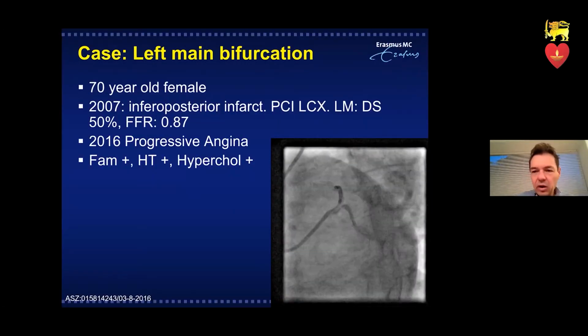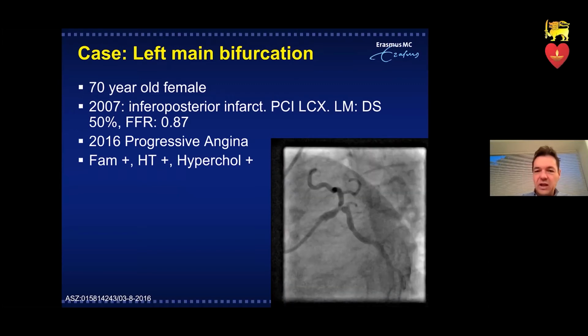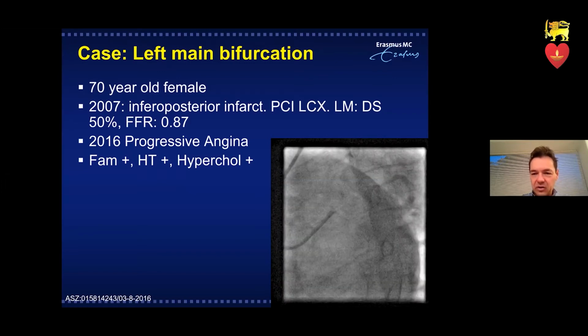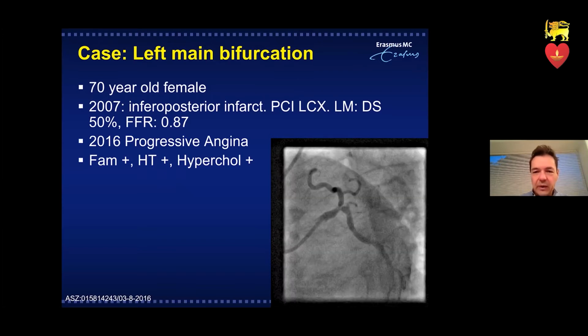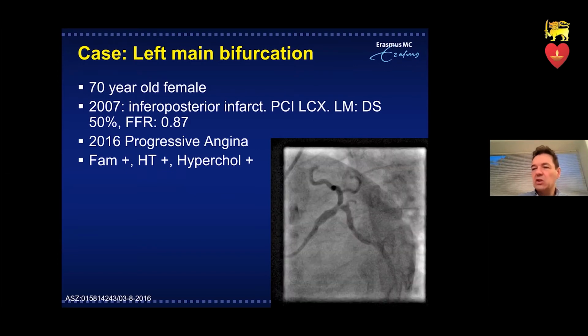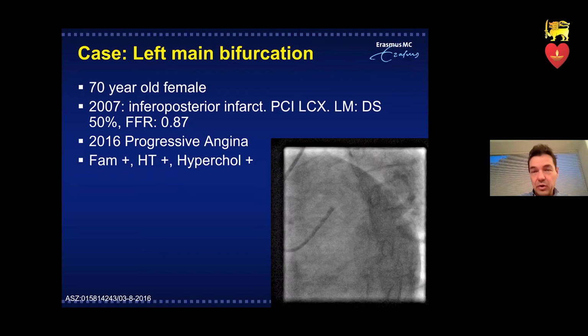Absolutely. I think all of us, the only wires I usually don't jail are the FFR wires, because they have a complex construction with the sensor, which is a little more bulky area. But all the other wires at the moment you can easily redo. What I don't do in the first step, that's my personal part of it.